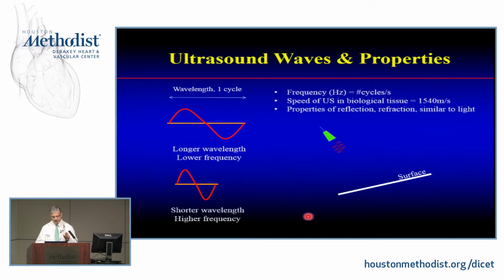Now, when you send this packet of ultrasound to a surface, it's going to do almost the same thing as light. It's going to hit it. If there's nothing else to hit, it's going to keep traveling till it dies. You need to know that ultrasound doesn't travel well in air. It travels very well in fluid.